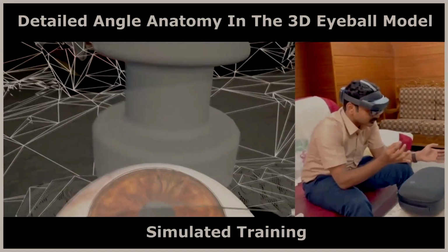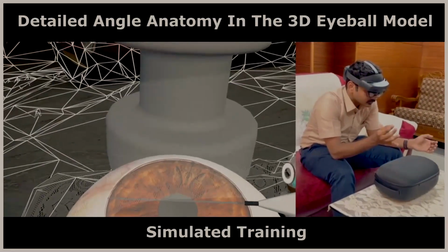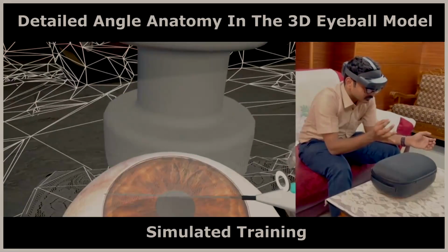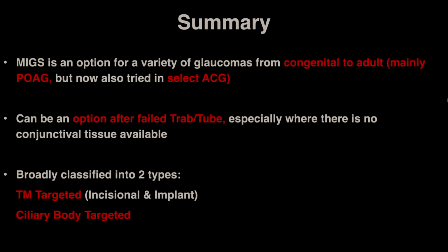Why can't we do something for MIGS, because you don't get to practice in a wet lab, and there are only some simulated models. So we have our own holographic simulator for MIGS where you can do n number of times the stent placement. In the right plane it turns green, and you can go ahead and get it done.